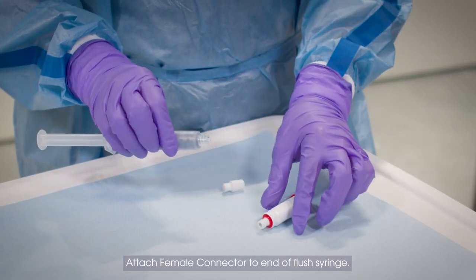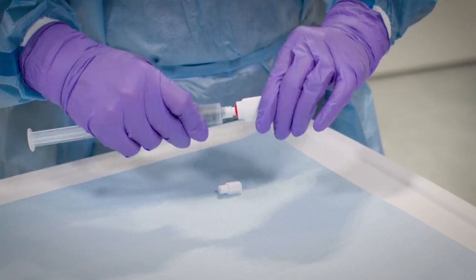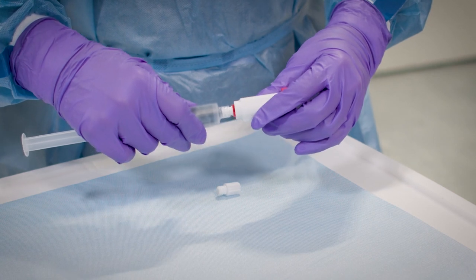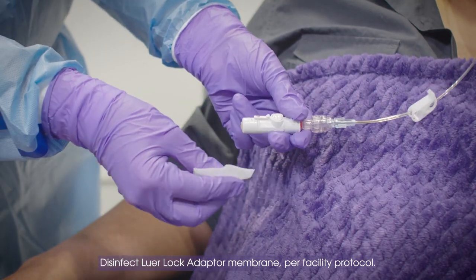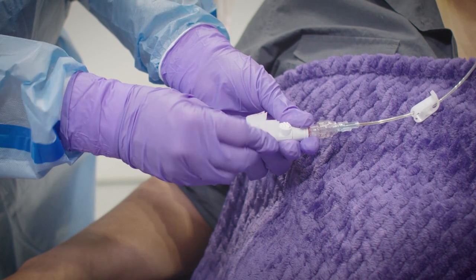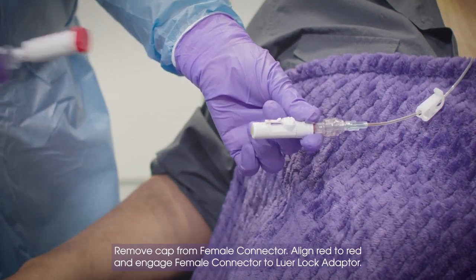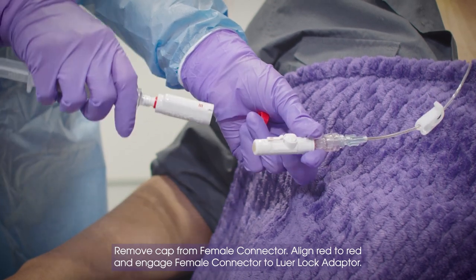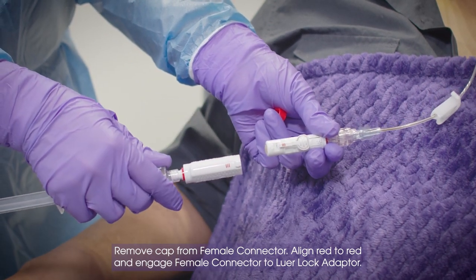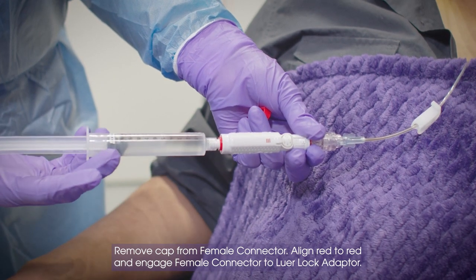Attach female connector to end a flush syringe. Disinfect Luer Lock Adapter Membrane per facility protocol. Remove cap from female connector. Align red to red and engage female connector to Luer Lock Adapter.